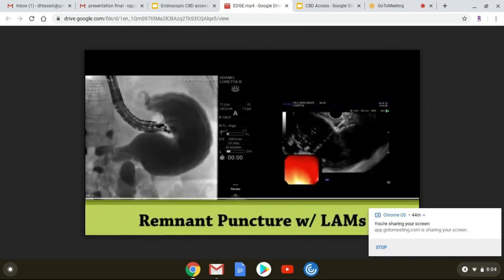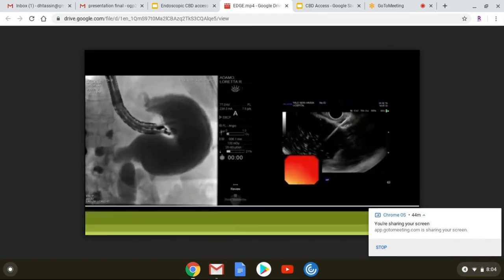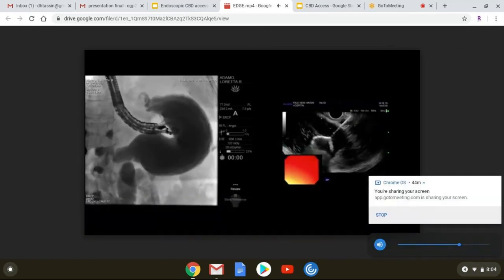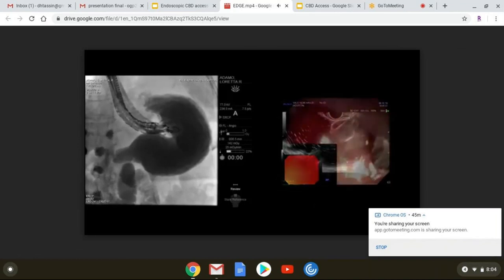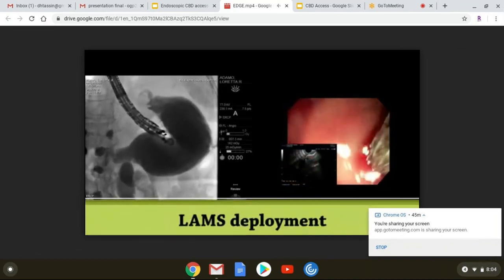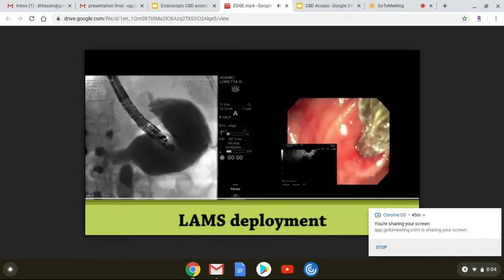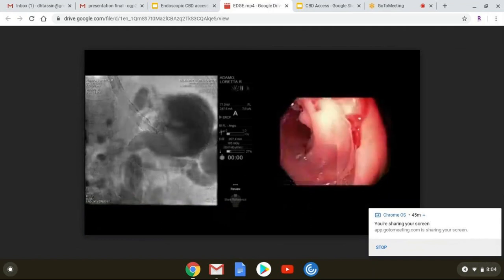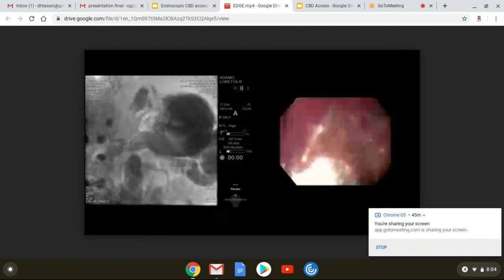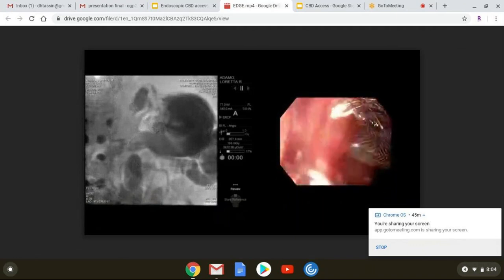So one scenario that I think... I didn't really realize you guys could do transgastric intrahepatic ductal access, but I'm thinking of a hilar cholangio where for whatever reason they can't get a stent up from below, and then people will go to PTC and then you struggle with that patient draining a liter of bile into a bag every day and you're trying to keep them hydrated. So you could instead drain that bile directly into the stomach. Is that what I'm understanding? Absolutely.